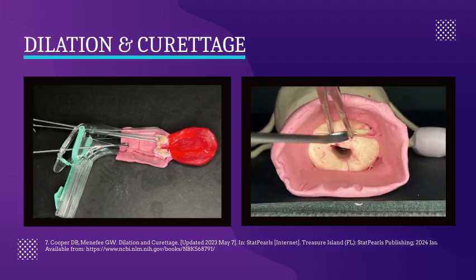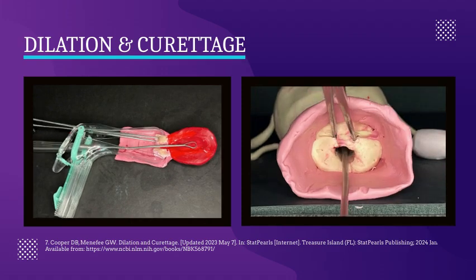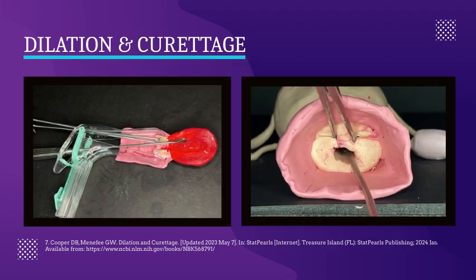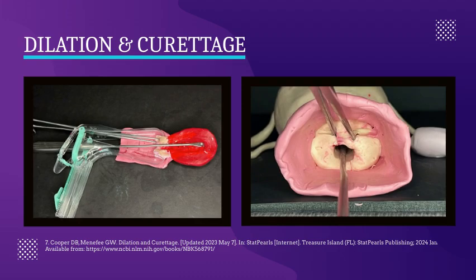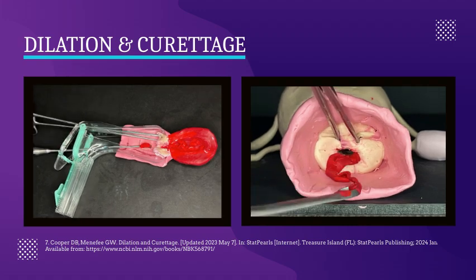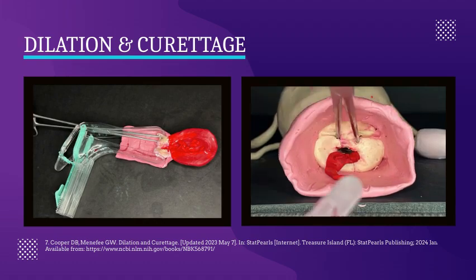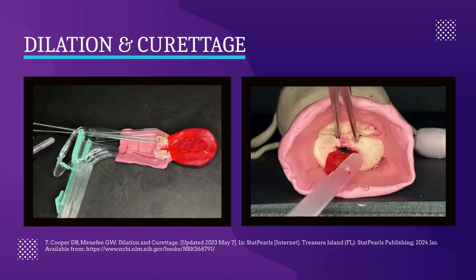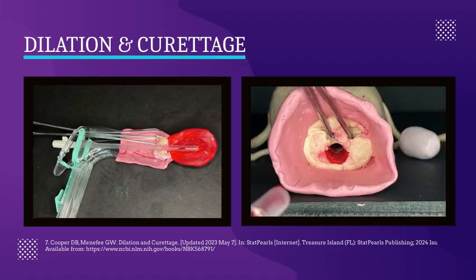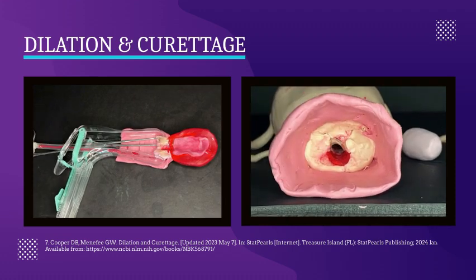After completing the number of passes required to evacuate uterine contents, select a sharp curette to perform a check curettage. Gently glide the sharp curette along the anterior, posterior, and lateral walls of the uterine cavity until a gritty texture is felt, with care to avoid perforation. This allows disruption of any adherent tissue and complete evacuation following one additional pass of the suction curette. Remove all tools from the uterine cavity and observe for appropriate hemostasis.